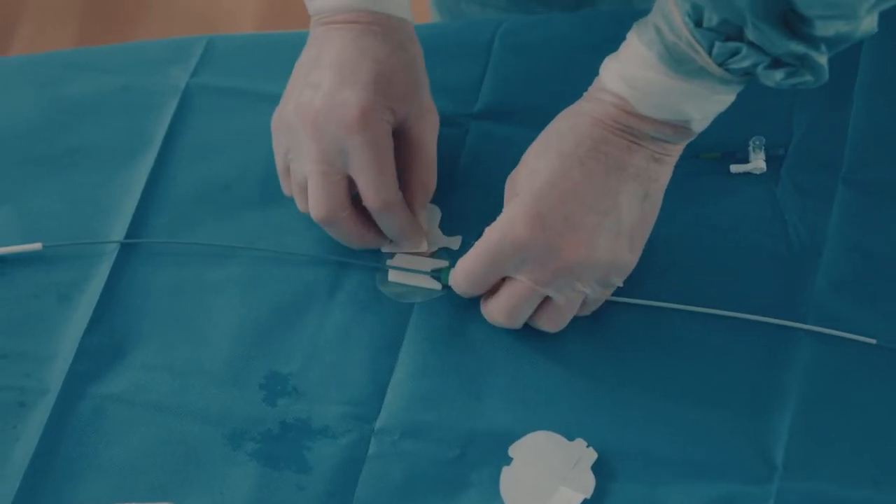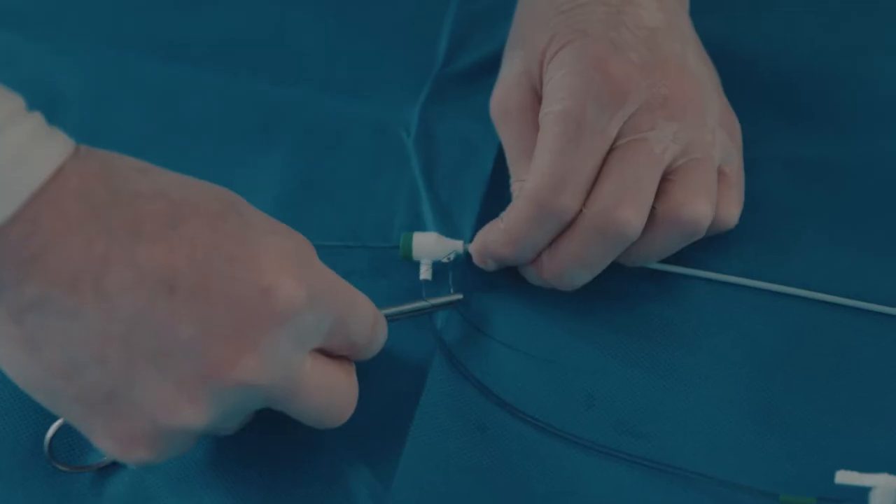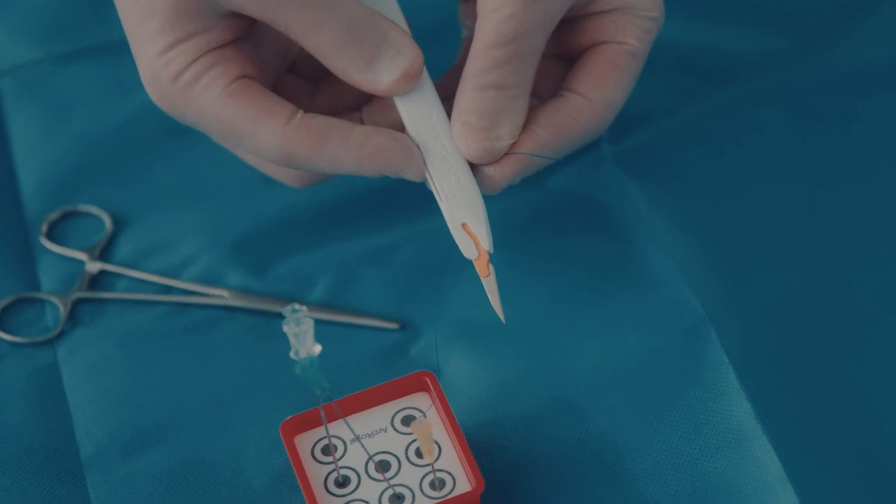Fixation of the catheter by the use of the fixation tape in the kit. Fixation using suture.